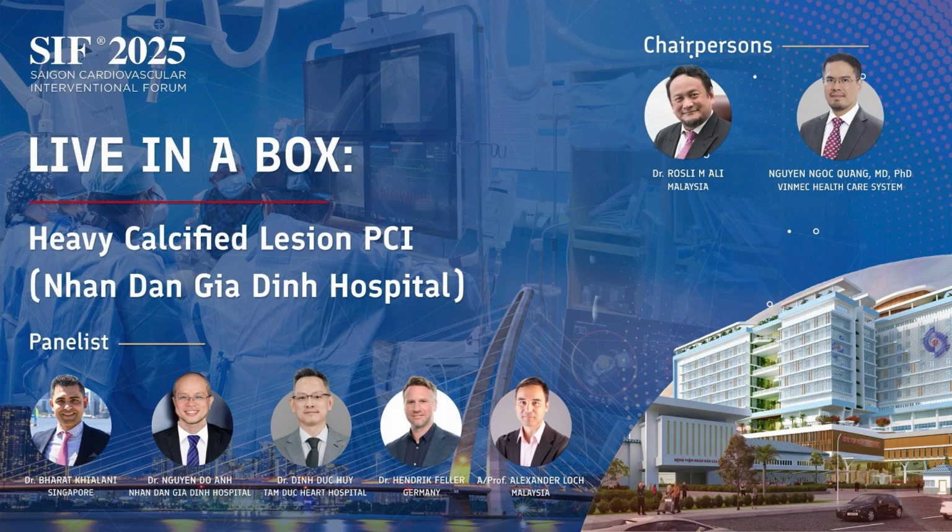So to clarify, in this situation you think the patient might need many IVL balloons, so that's why you choose orbital, right? Yeah, I'm not a heavy IVL user, I have to confess that. But I believe I would need different balloon sizes to cover the mid to proximal LAD and left main. And wire bias is an issue in atherectomy, and I think Rota would be difficult to ablate a good portion of it.